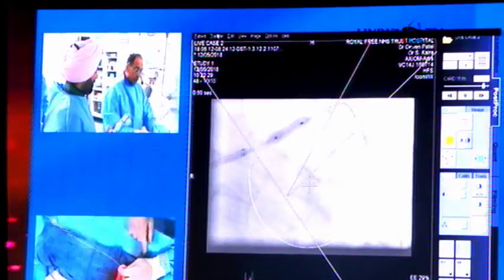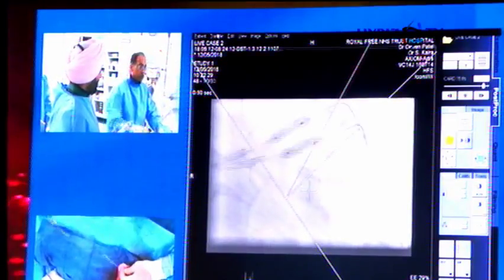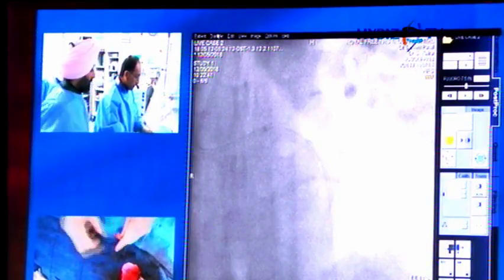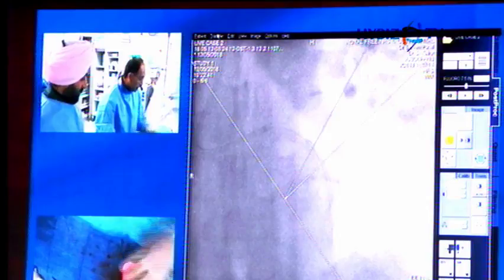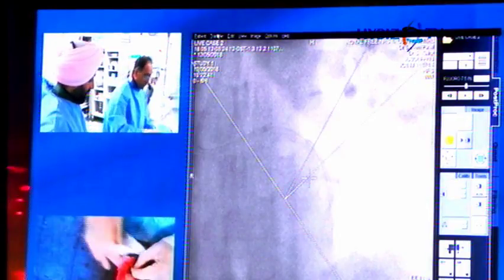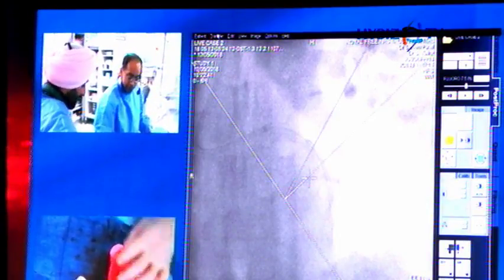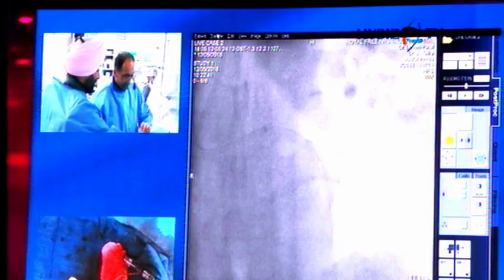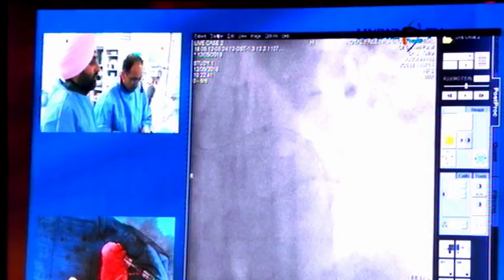Note that I'm not going to check with contrast again to limit contrast, so we rely on the OCT as a way of telling us where we are. To limit contrast, you should avoid just doing check angiograms in between unless you have a clinical problem. Okay, so OCT catheter is ready. If you've got about 3-4 minutes, we should be able to complete the OCT. Take your time. I think we're doing great, so we'll just see the final OCT with the expansion. Fantastic.